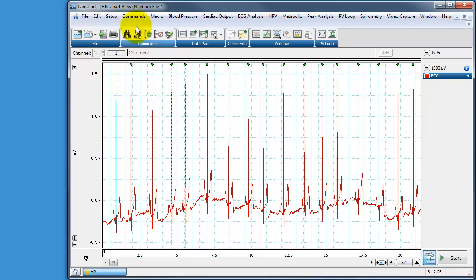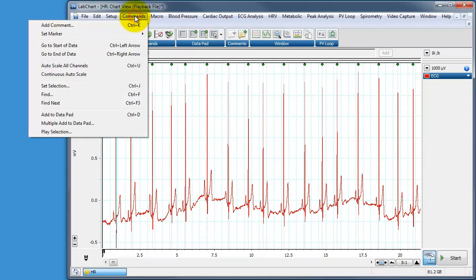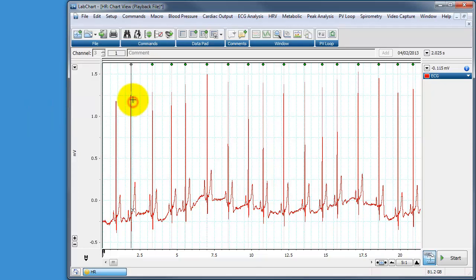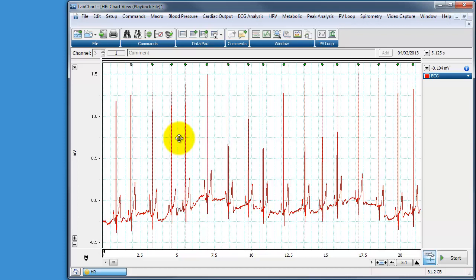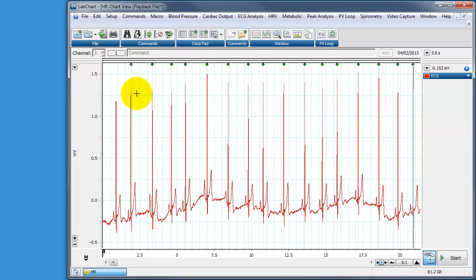If I then repeat this by going to command find next it will find the next peak and if I press control F3 which is a shortcut for that it will find the next peak and if I keep pressing it it will keep zapping through and find all of my peaks. So we know that that function works quite well.